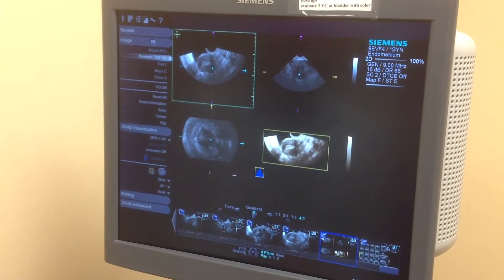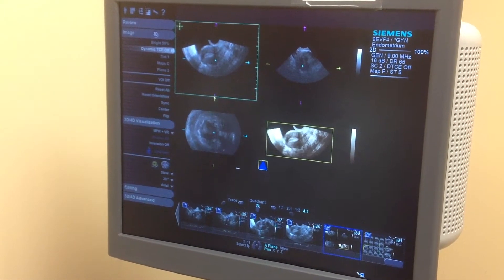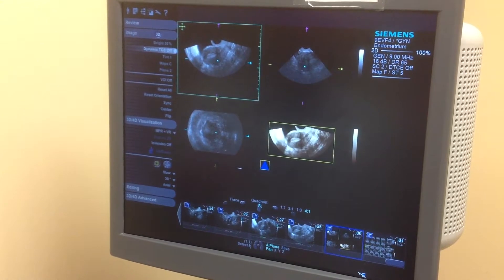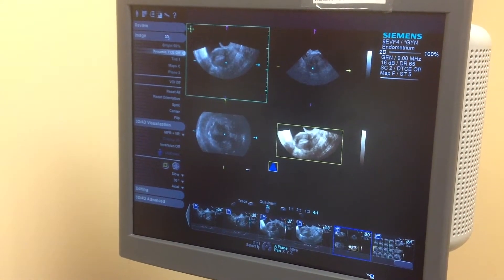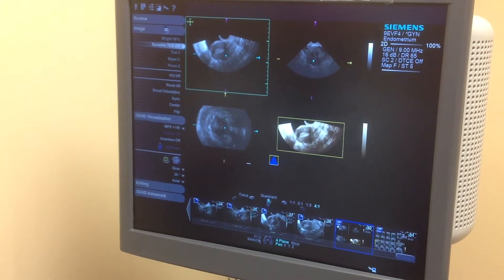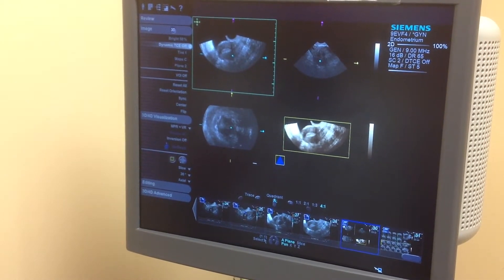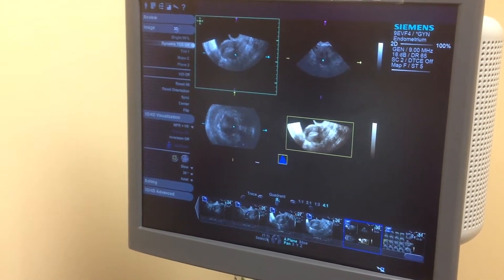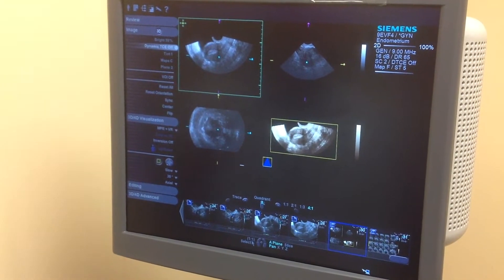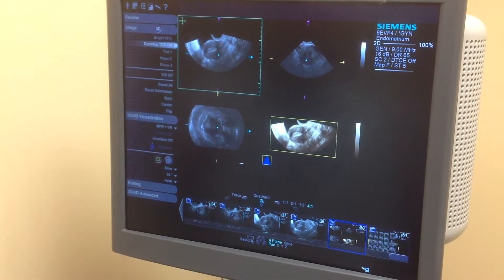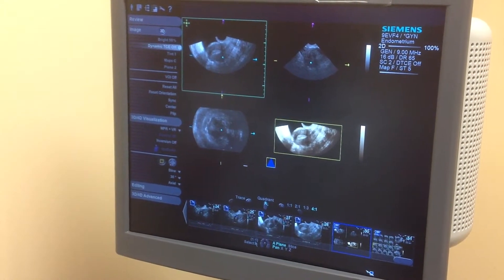We're going to show you the reconstruction of the endometrium here. You can either do it on the fly when you're doing your initial sweep with the patient — when you get really good at this, it's only going to take about 30 seconds to do all your manipulations. In the meantime, you can save your volume as shown in the other video clip and then come back and manipulate it after the patient has already gone.